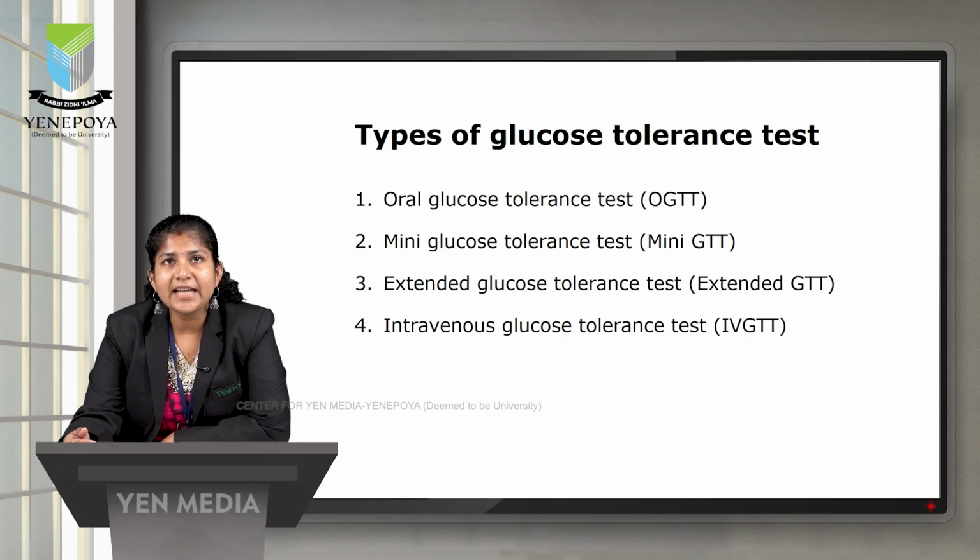Next we will see the types of glucose tolerance test: oral glucose tolerance test, mini glucose tolerance test, extended glucose tolerance test and intravenous glucose tolerance test. These are the 4 types of glucose tolerance test we are doing.